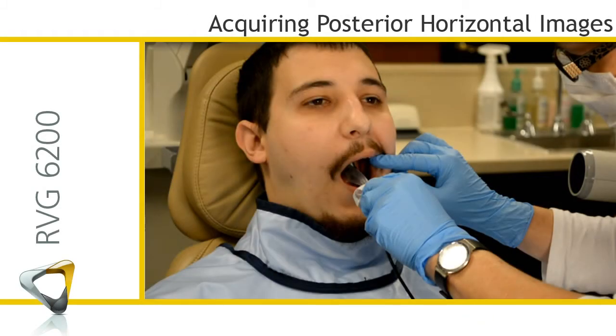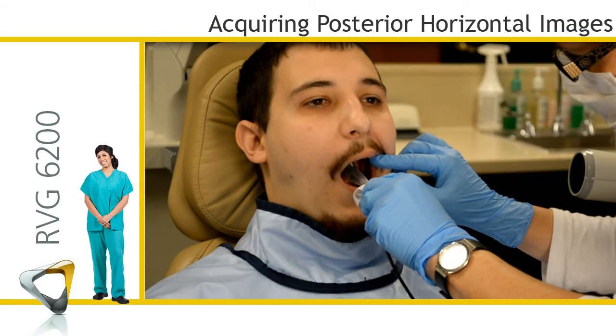RVG System – Acquiring Horizontal Posterior Images. This recorded class is designed for clinical team members and provides instruction on acquiring horizontal posterior images with the RVG system.